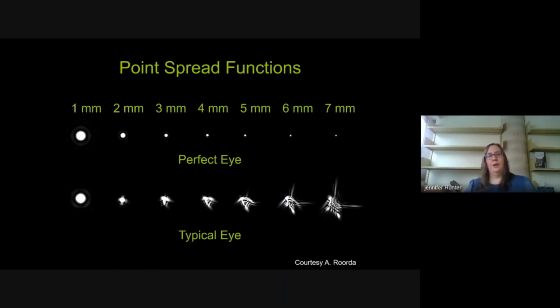And so we would be dealing with a 3 millimeter, 3.5 millimeter pupil if we wanted to think about commercial systems. They're often focusing into the sweet spot that's matched between diffraction and aberrations. But if we can get to a larger pupil diameter, a higher resolution by going to a 7 millimeter pupil, we need to be able to correct those optical aberrations. And of course, to do that, for the past 20 years, we've been working in adaptive optics.